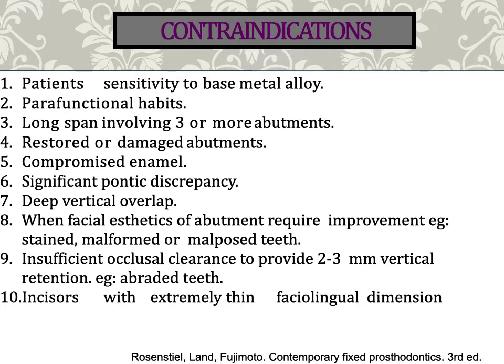Contraindications include patients' sensitivity to base metal alloys, patients with parafunctional habits, long span involving 3 or more abutments, restored or damaged abutments, compromised enamel, significant pontic discrepancy, a deep vertical overlap, and when facial aesthetics of the abutment require improvement, for example in cases of stained, malformed, or malposed teeth. Also when there is insufficient occlusal clearance to provide 2 to 3 mm of vertical retention, and in incisors with extremely thin faciolingual dimension.